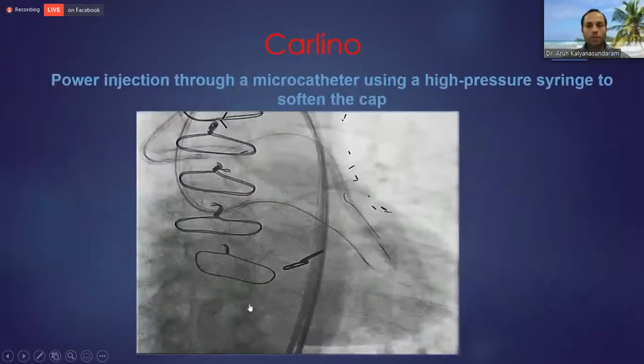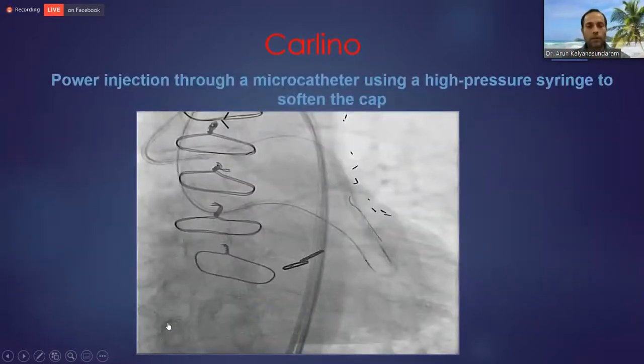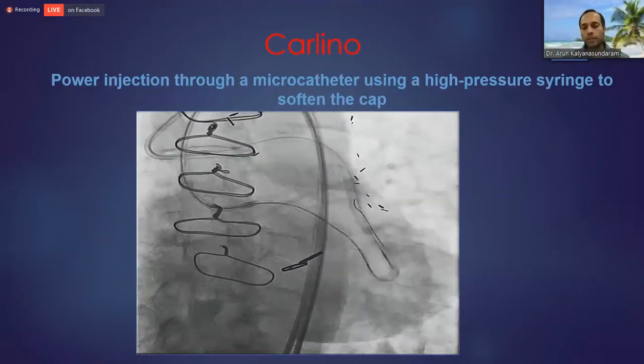Okay, Carlino, I'm just going to go back. Sorry, just skip two there. Okay, Carlino, and I'll have better pictures of this, essentially is when you dissect with contrast through a microcatheter.